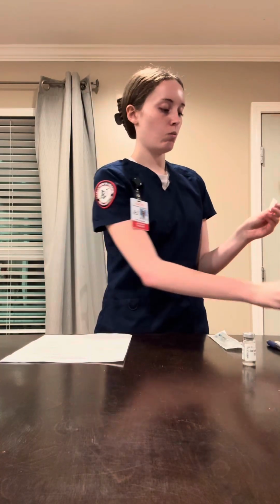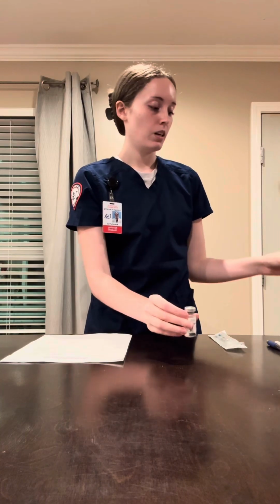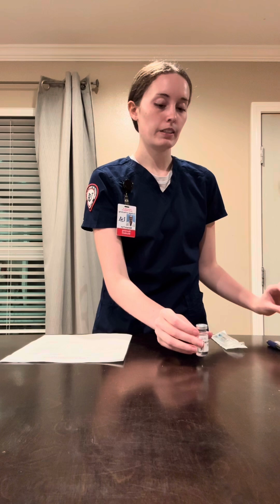All right. So now what I'm going to do is take an alcohol swab, open that up, throw that away, and clean the vial. So clean it really well, making sure I get into every crevice to prevent contamination. Okay, so place that to the side.